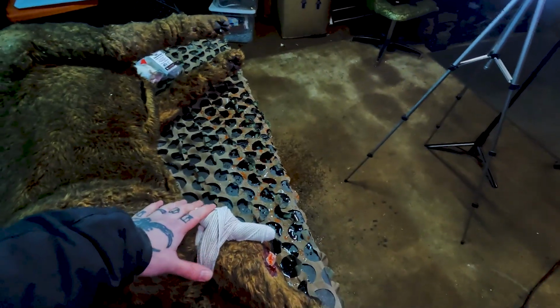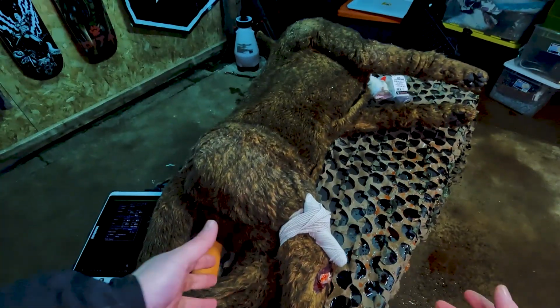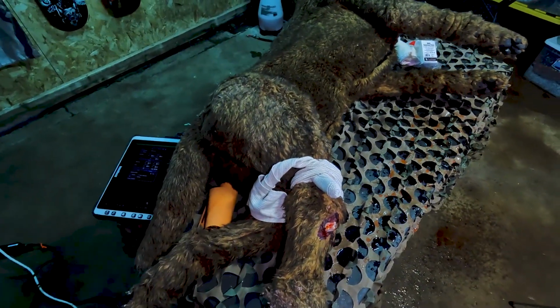And this is one of the things you'd want to check each time you move the patient in case it shifted and is no longer working. You may even want to use some tape or something to secure it in place to make sure that that tuck doesn't come undone at some point.